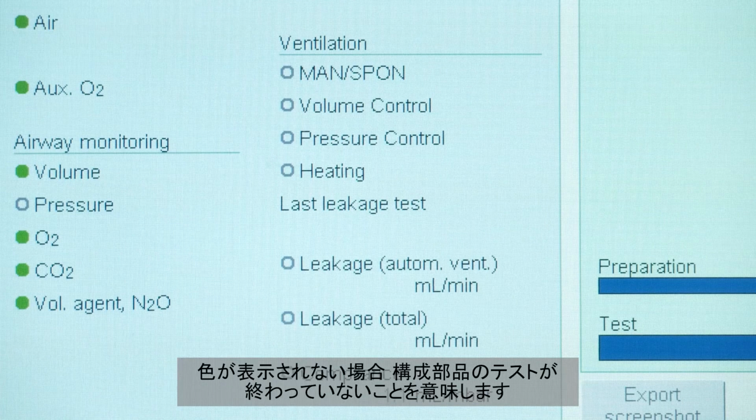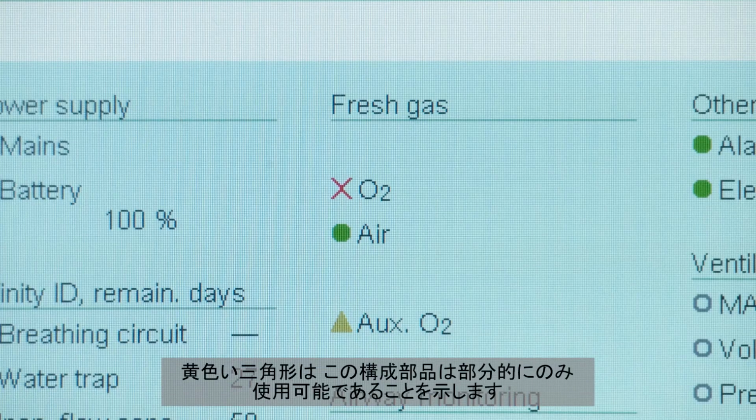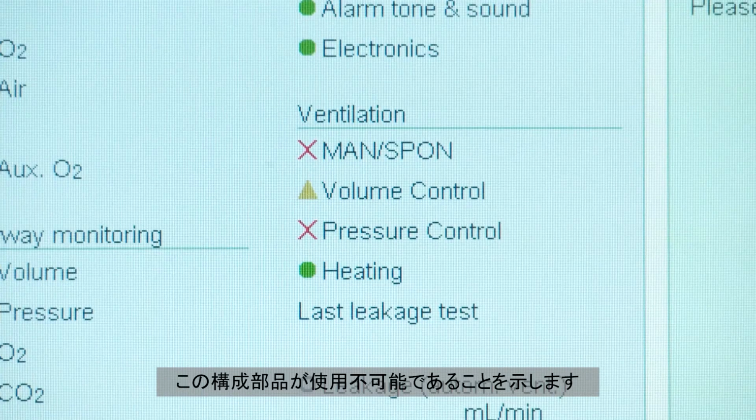No colour means that the component has not yet been tested. A green dot indicates a passed test. A yellow triangle indicates that this component is only partially operational. Perseus can be used with the respective restrictions, however. A red cross symbolises a failed test and indicates that this component is not operational.